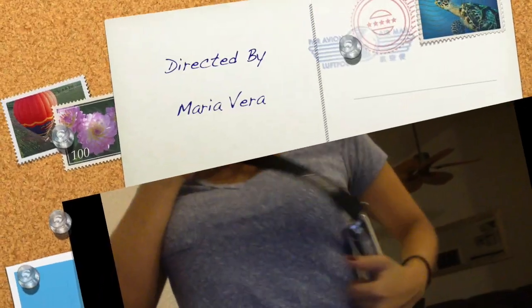So I will show you very quickly the different ways that Brandon could carry his communication book, besides holding it in his hands. This strap gives Brandon the opportunity to just carry it like this without using his hands, or he could even put it around his neck and walk around.